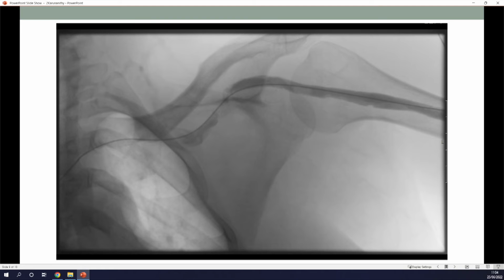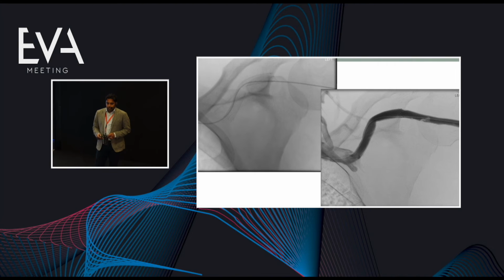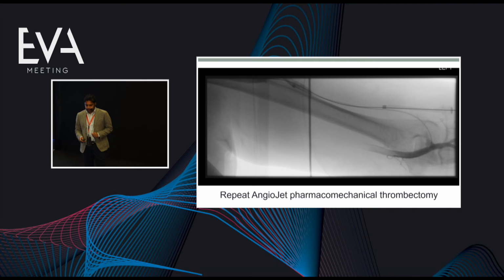Having done the thrombectomy, the fistulogram revealed a high-grade stenosis of the cephalic arch, and a little bit like your case yesterday, Bart, I was quite concerned that this might rupture even with fairly low diameter balloon angioplasty. So I opted to put a covered stent in the segment and post-dilated it and established good outflow into the cephalic and subclavian veins.